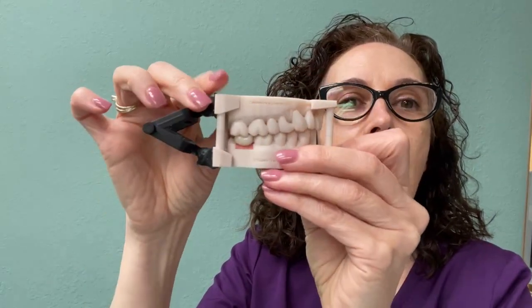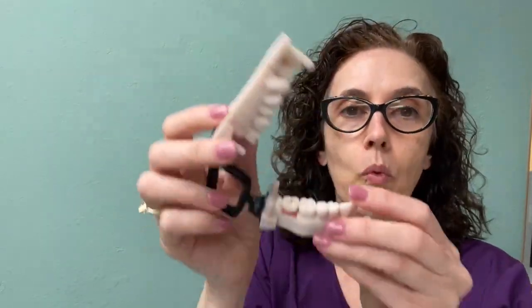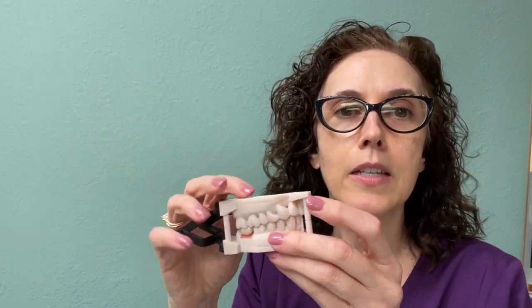So that's how you can replace a missing tooth, either by sending in an impression or by sending a scan, either by having a custom abutment and a crown cemented into place, or by having an abutment and crown that's already attached as one piece that is screw retained, because then at the top where that hole is, we fill that in with a filling type material. And that's a way that you can have a missing tooth be replaced by having the implant placed down in the bone and then the abutment and the crown placed on top of that.